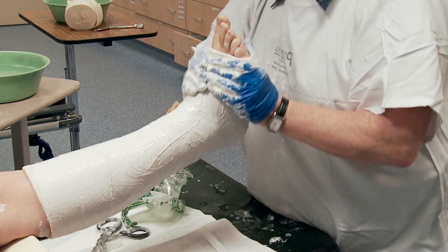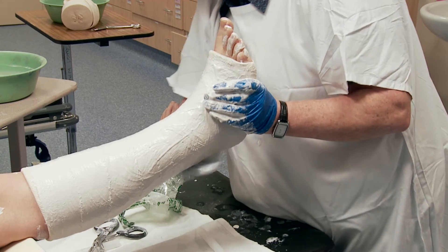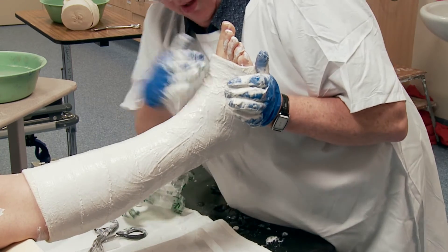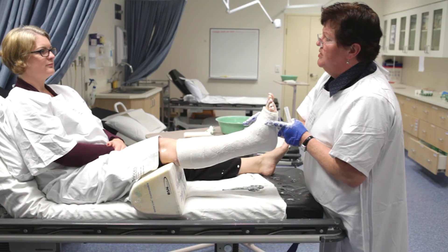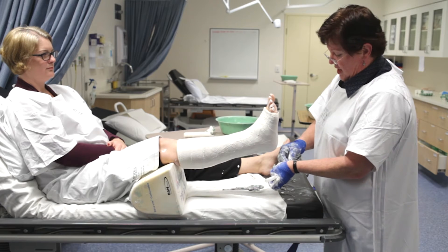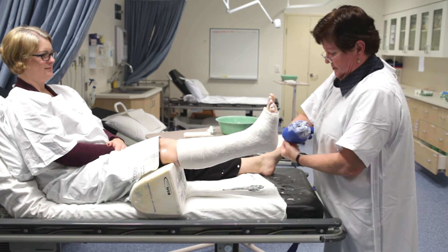There you have it. For the purpose of the demonstration it should come a little bit further up than your big toe, but there you go — you're done. Clean up your mess. If your toes turn purple, blue, or you experience numbness, tingling, or any pain sensation, go straight back to emergency and get it cut off. Otherwise give it ten minutes to set and you're off.